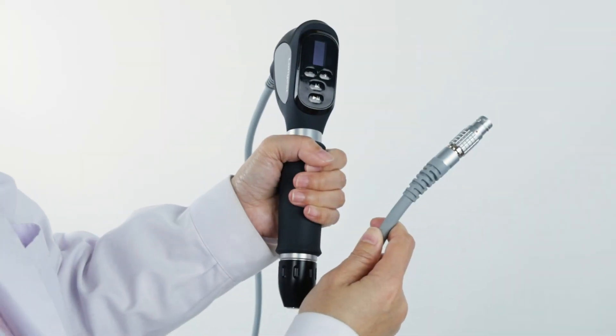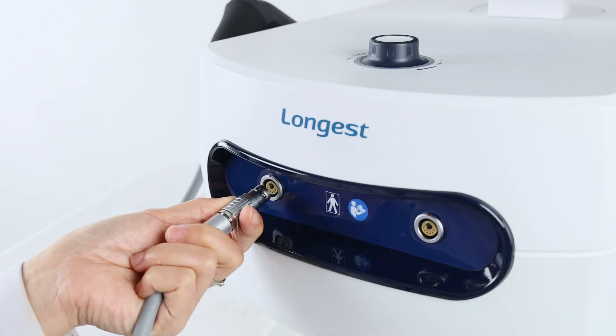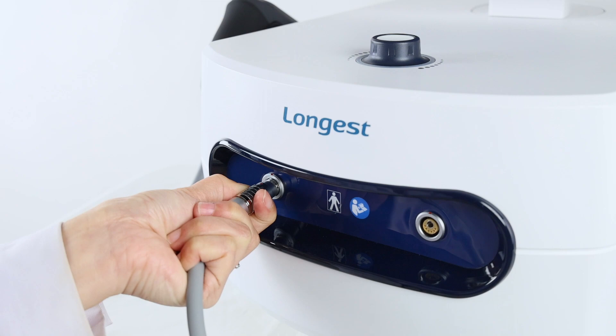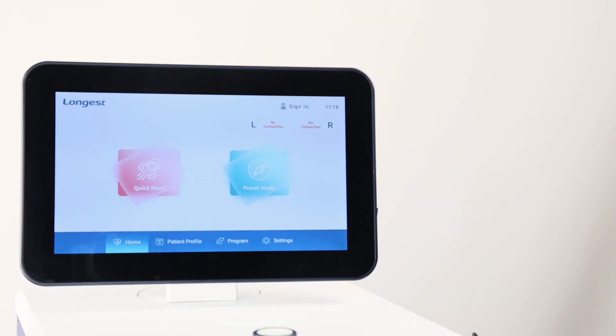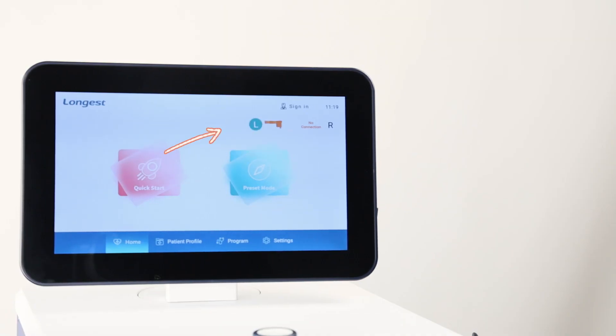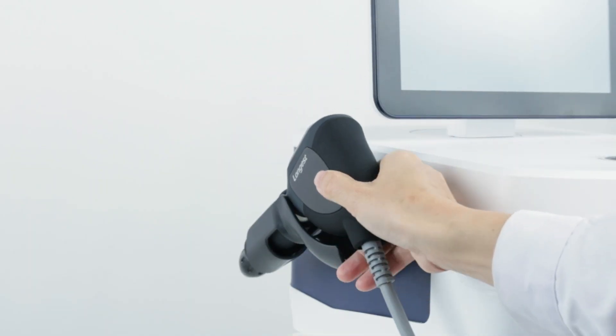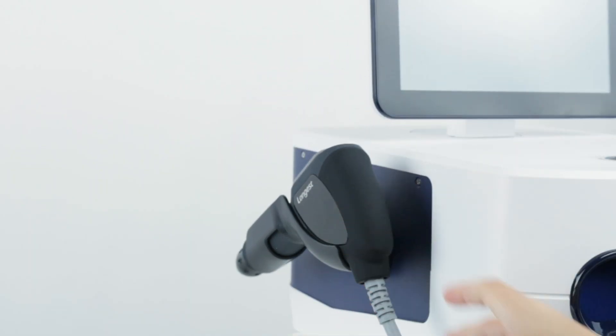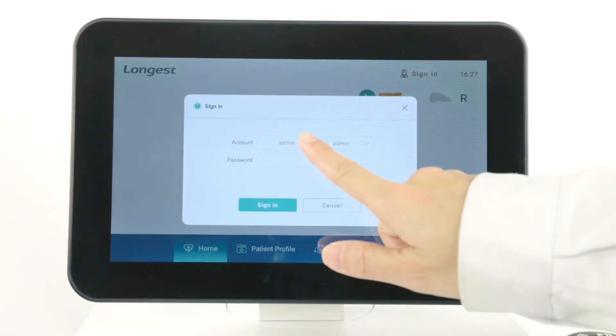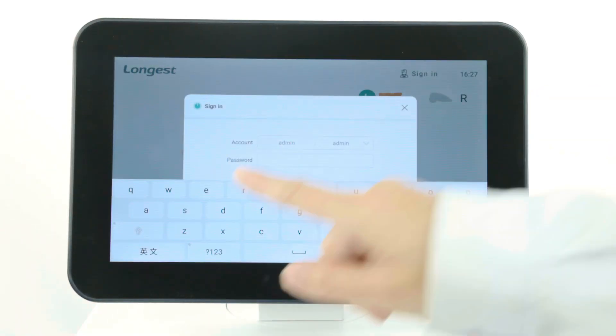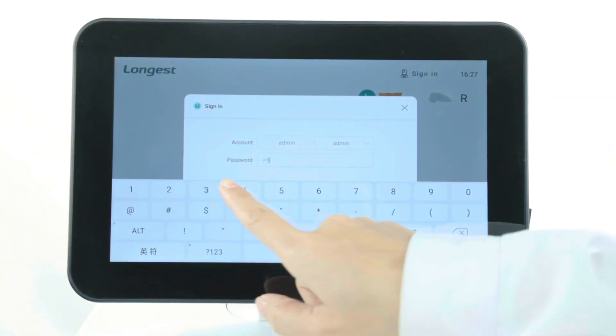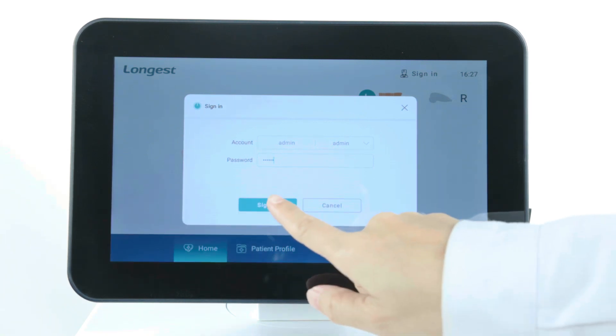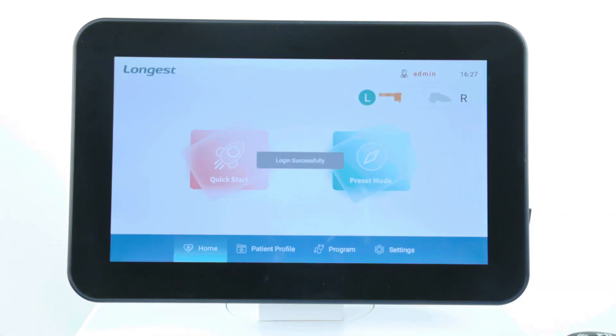Then, connect the general handpiece. The device can automatically recognize the connected handpiece. The system has a built-in default administrator account. Before operating, sign in the account with the given password.